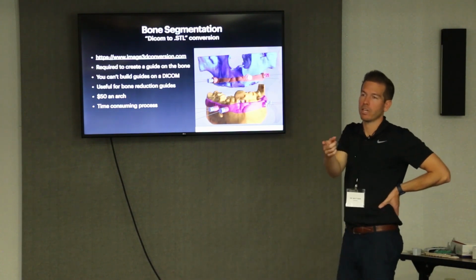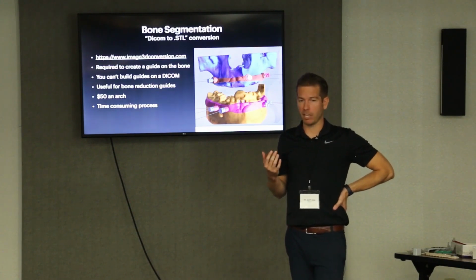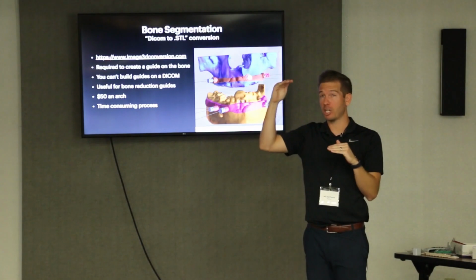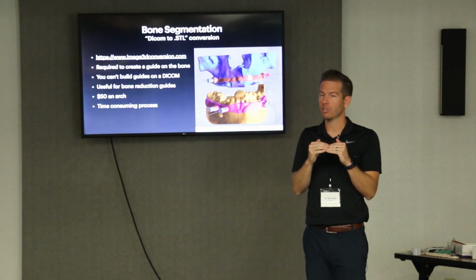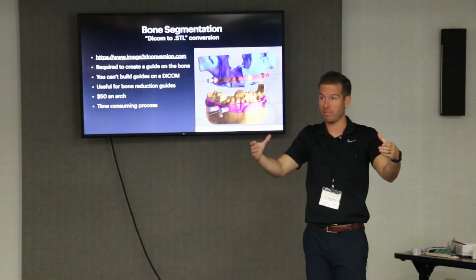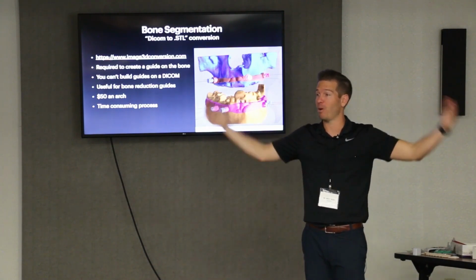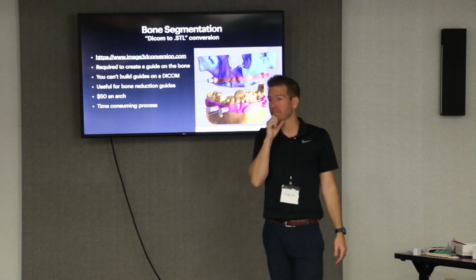And then the other thing is, okay, that flat drill, fine, but I found myself shying away from it a lot because the flat drill is a 5 millimeter drill, and if you take it to depth at your offset, it's going to go to the implant platform. So now, if we're placing subcrestal implants and you're drilling a 5 millimeter osteotomy, you've blown that ridge out. And how many ridges are big enough to support a 5 millimeter wide osteotomy and still have good bone on both sides? It's not that often. So I don't love that one.